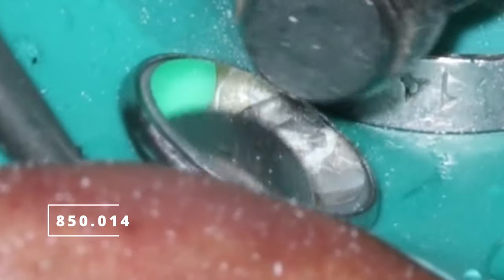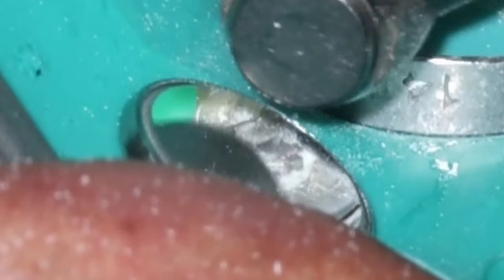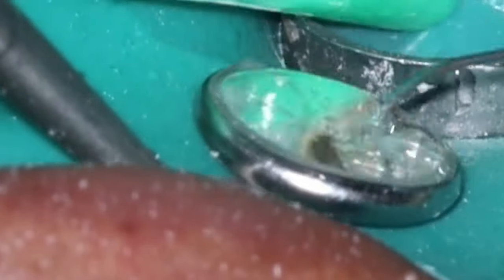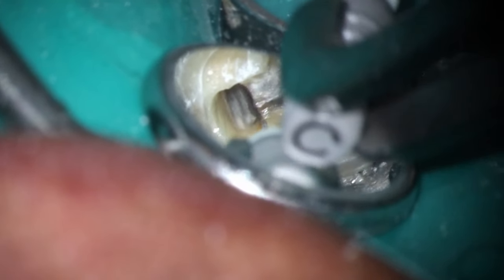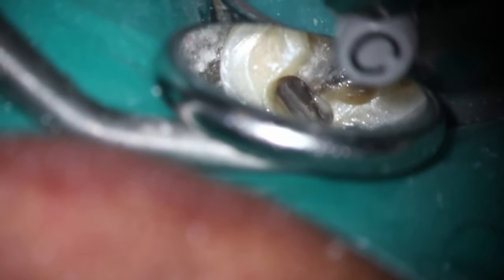So if you're trying these out for the first time, my recommendation is to go a little bit more towards the mesial. I was able to get into one canal — need to grab the other one here — and just kind of go back and forth. Some people will do two single holes for MB and ML. I find that the mid-mesial is a lot more prevalent than you think. There's actually a tiny little one here — it didn't go into anything, but I still like to clean that out. You just trough from buccal to lingual.